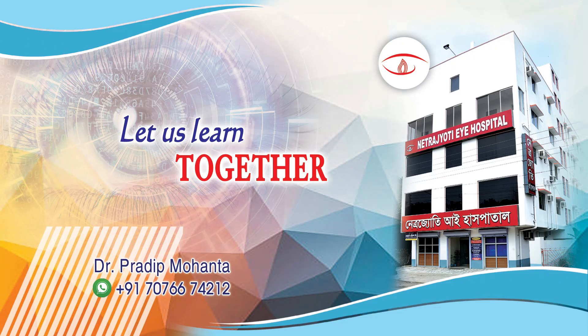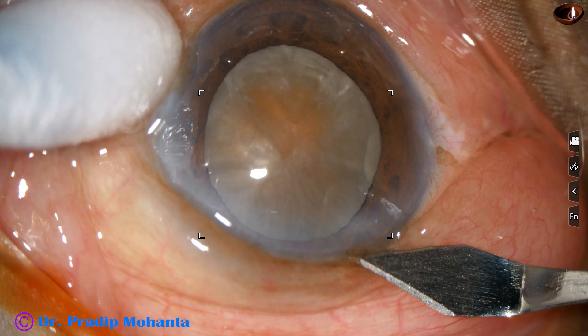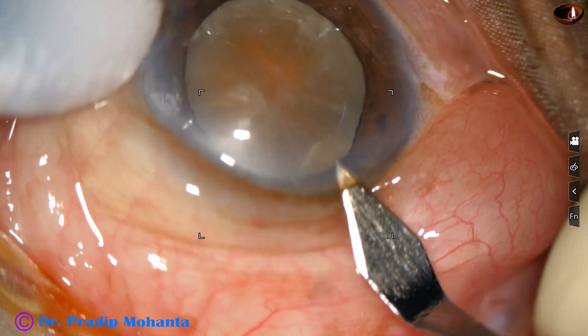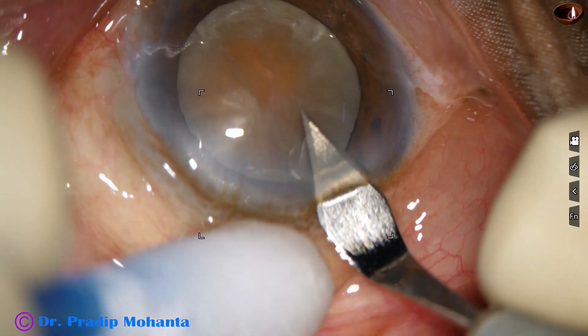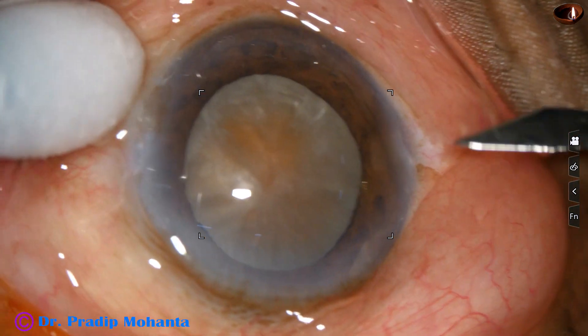Friends, welcome to my workplace at Ranagh Heart, West Bengal, India. Let us observe management of this mature senile cataract. We can see the brown tinge of the nucleus, so the cataract is going to be quite hard.